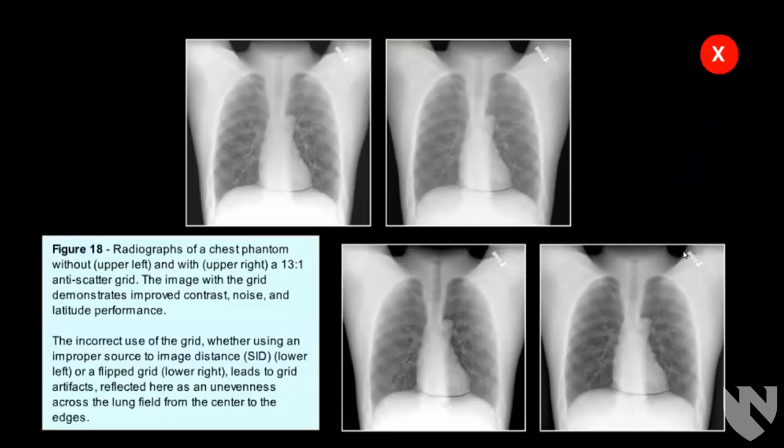So these images are from one of the modules. It's kind of hard to see, unfortunately, but it's examples of different misused grids. You can imagine where things are maybe harder to see in the center versus not on these. They show the differences in mispositioned grids and everything, but unfortunately I didn't think it came across very well in this presentation.